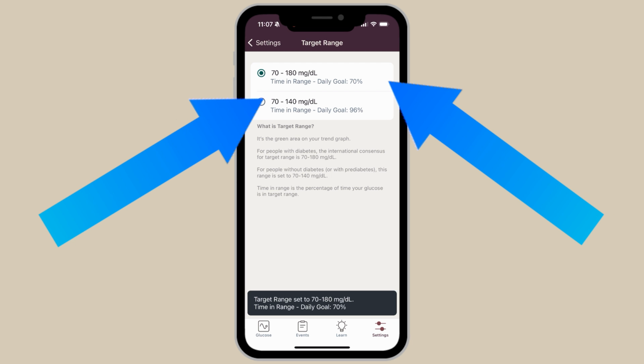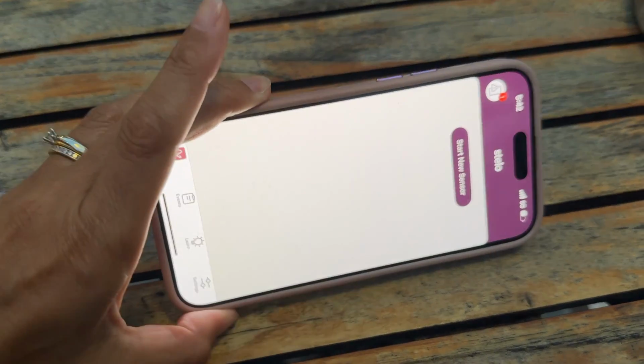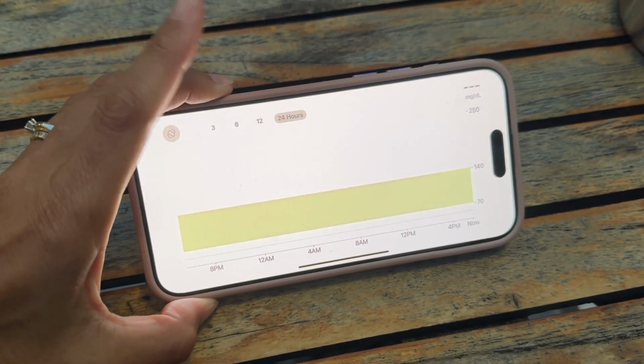But what I don't love is that once the sensor is done, you have no information here in the app. It's a blank screen. And my guess is that most people don't know that they can download the Dexcom Clarity app or go to dexcomclarity.com and see their historic data. I went through all the training material for Dexcom Stelo and I did not see that highlighted anywhere. Did you ever open Dexcom Clarity? Did you know it was an option or did you use it?